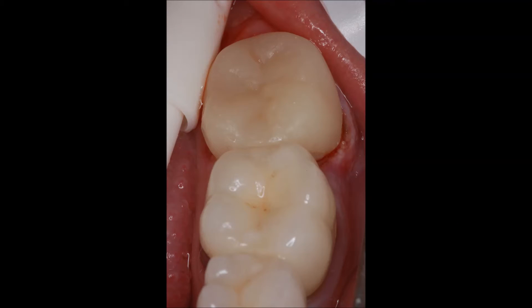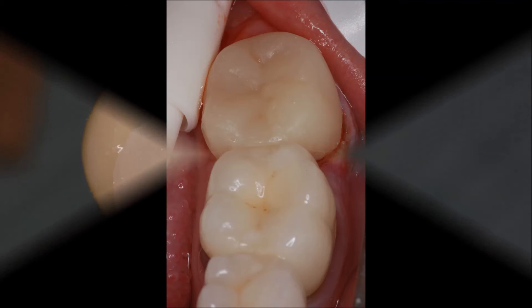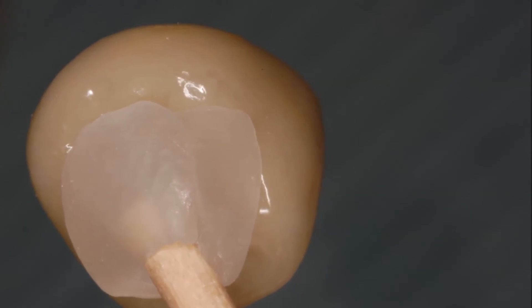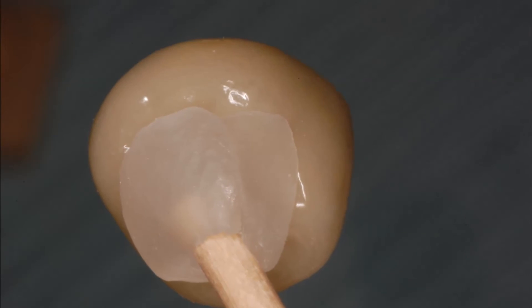Temporary crown on tooth number 18. Utility wax secures the Emax crown to a wooden stick, making for easy delivery.